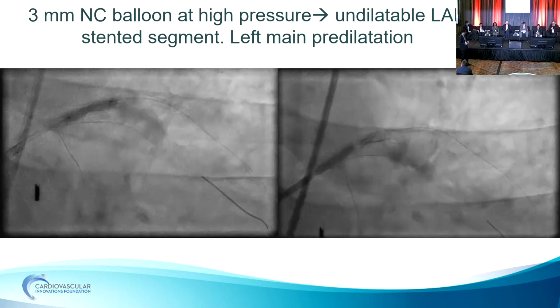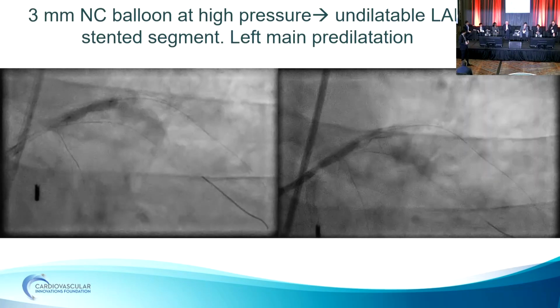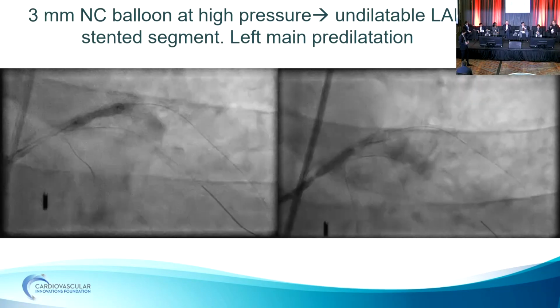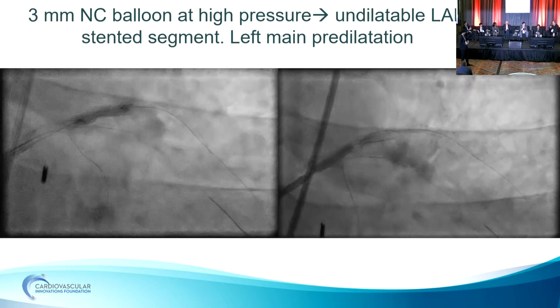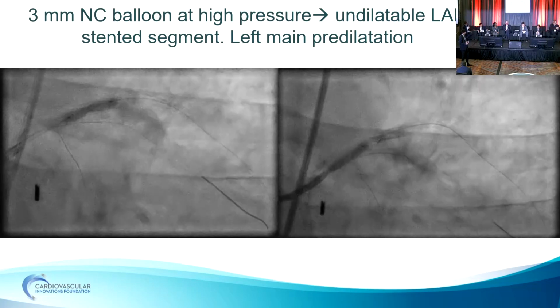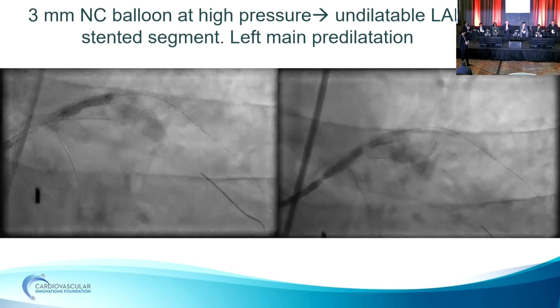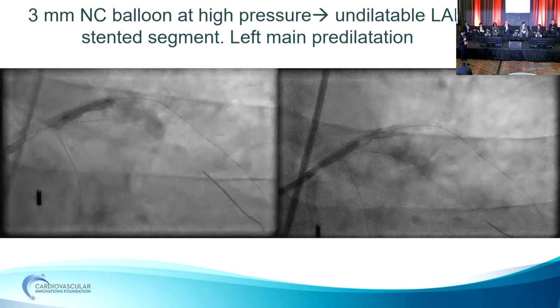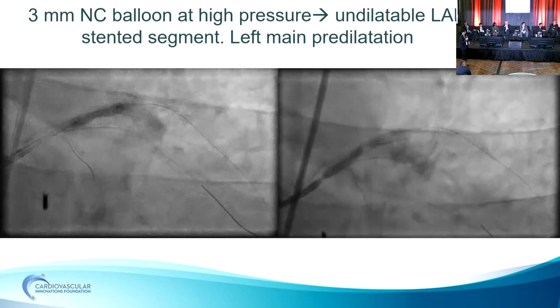Yeah, I agree with Shockwave for sure. Plus or minus Rota if needed, but I think Shockwave will soften up that calcium and will allow you to expand that stent better. Great. Yeah. And now that we have DCBs on our shelves, we can use that as an adjunct at the end of the case. Yes.